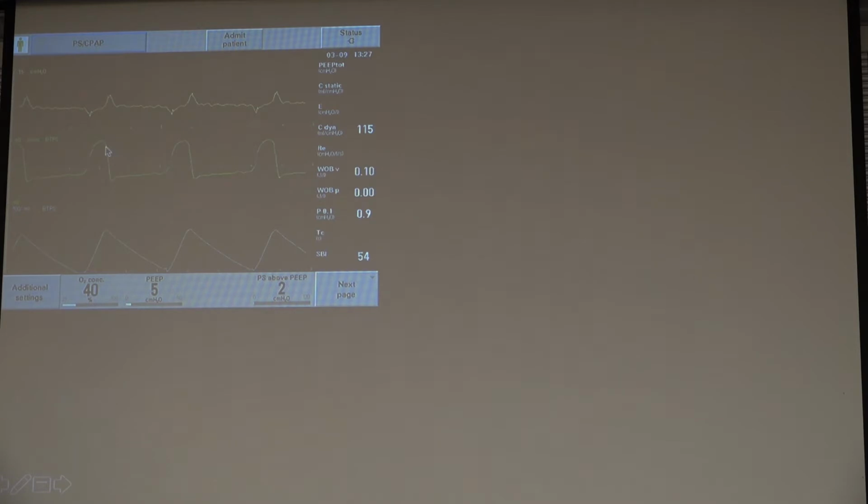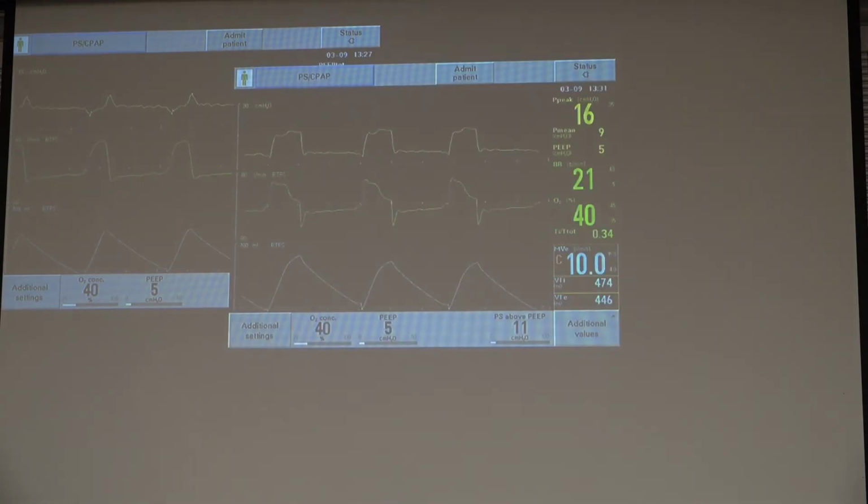But the issue there is, looking back at flow again too, here's flow of 60 as the top of the graph, so this person's flow on that pressure support is about 45, and they're not happy about that. And so they're pulling a lot harder, trying to get more flow for their patients. So how do we treat this one? And you guys all know this. Increase the pressure support, right? Increase the pressure support up to 11. We're going to achieve at least initial flows that are much more appropriate for the patient, and a patient with much less effort during that inspiratory time.